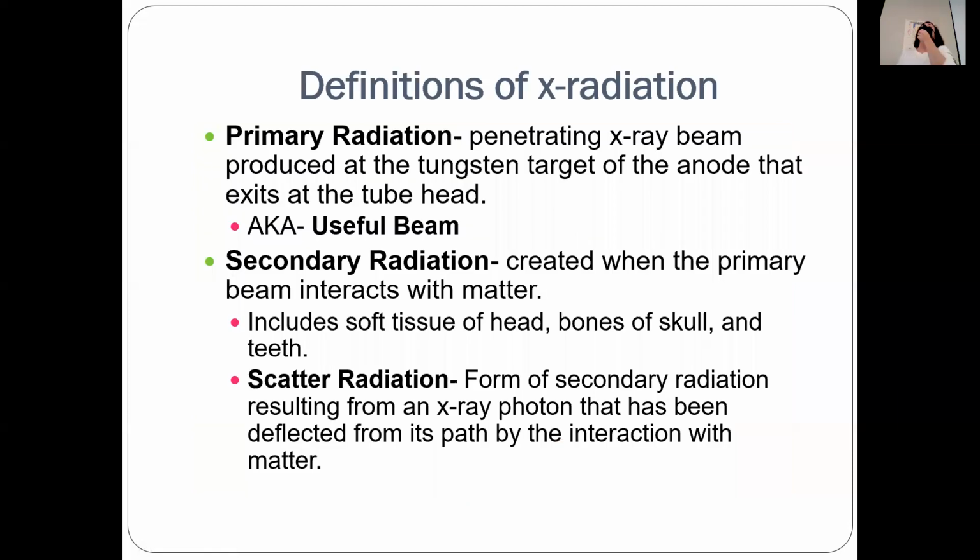Question: the collimator and the length of the BID basically determine how the path of the X-ray is going to be? Yes, it helps to restrict the size of the beam. With the collimator and a longer BID, you really just want it to cover the sensor and nowhere else, ideally. We're going to get X-rays other places, but these are things that help restrict it.